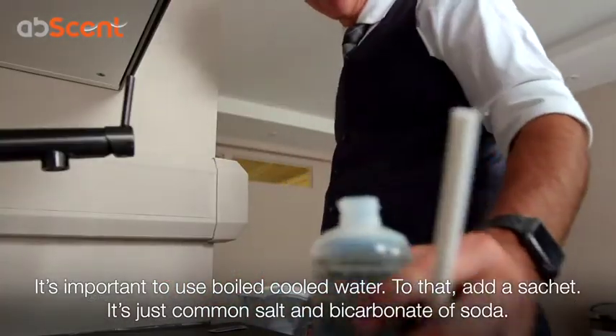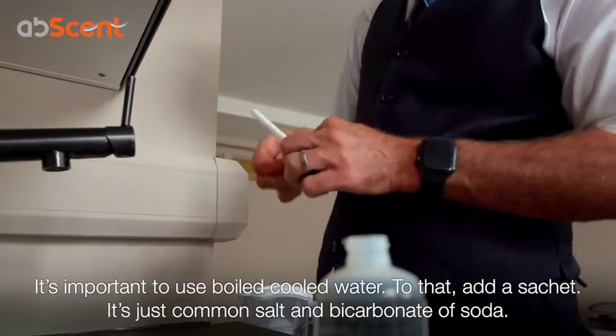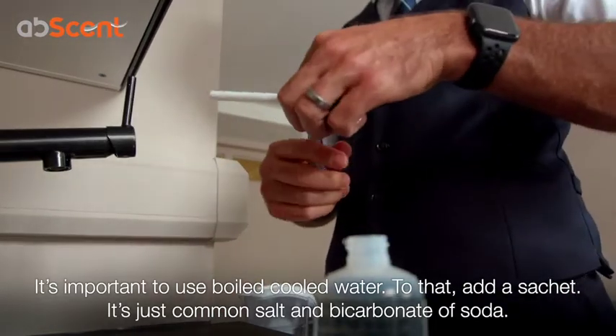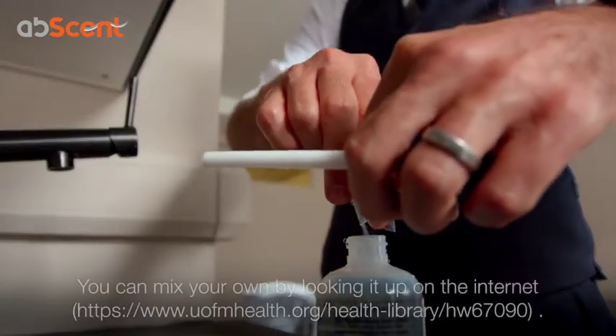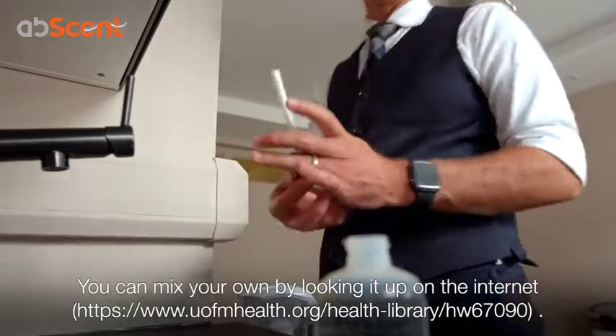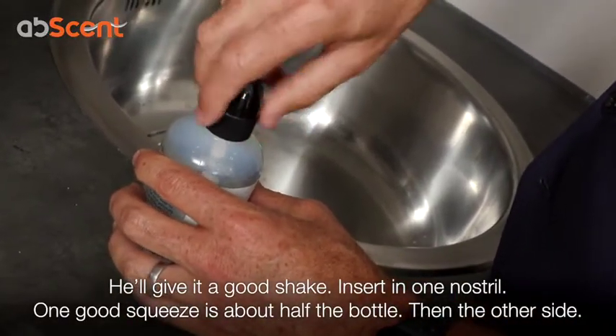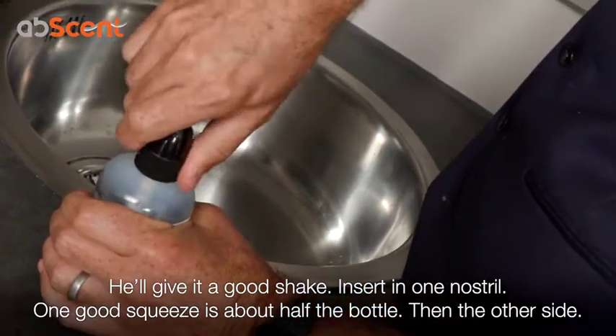And then to that, he's going to add a sachet. This is just common salt and bicarbonate of soda mixed up in a packet. You can make your own mix if you look that up on the internet. So he's added the packet and then he's going to give it a good shake.